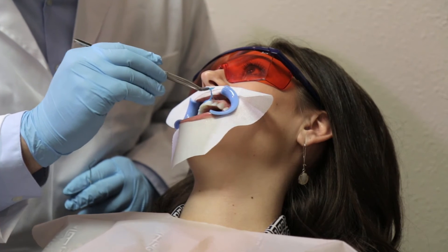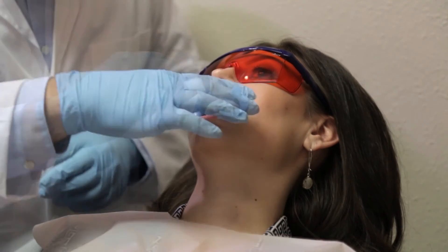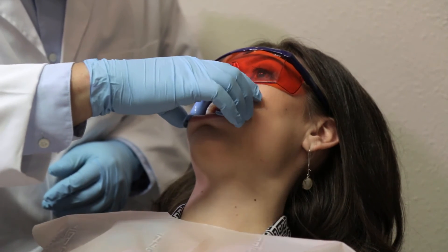Remove the gingival protection, cotton rolls, face protection cloth, cheek retractor, and protective eye goggles, and ask the patient to rinse his or her mouth with water.